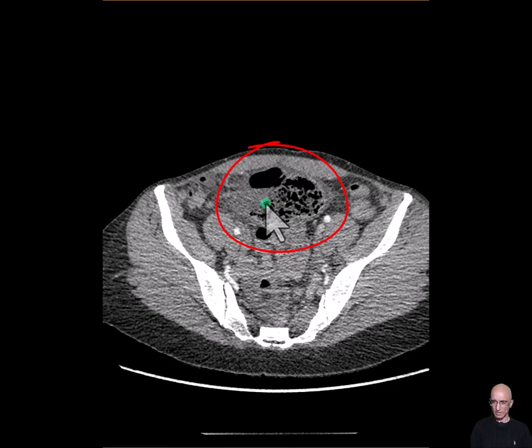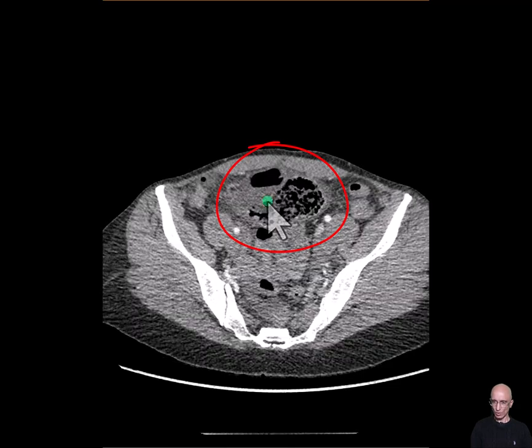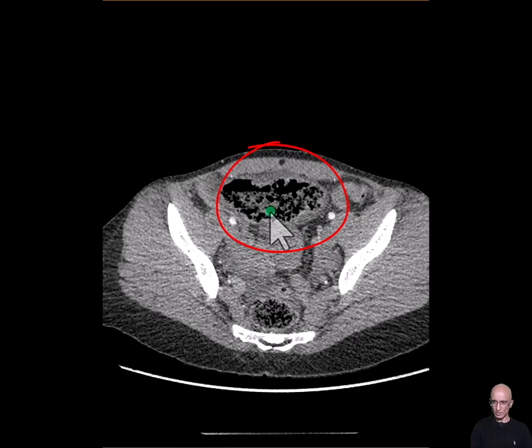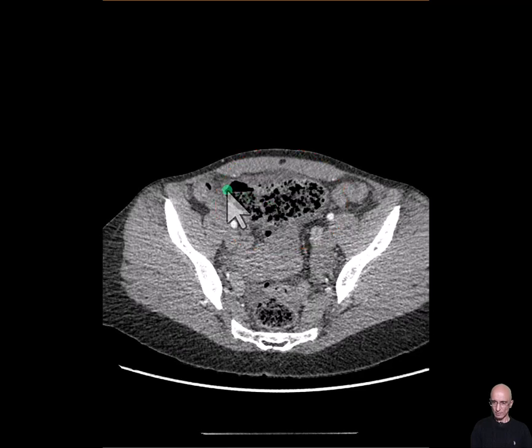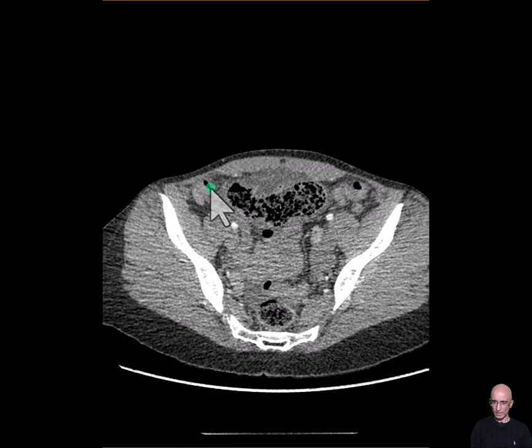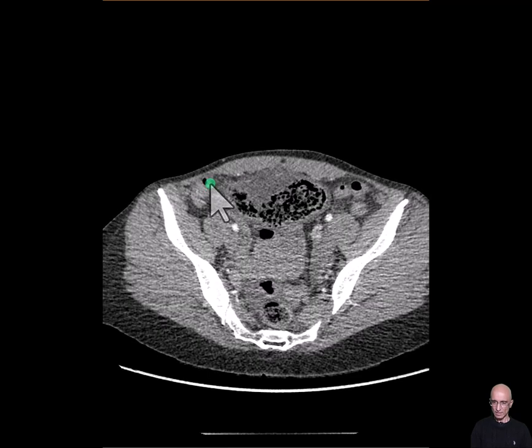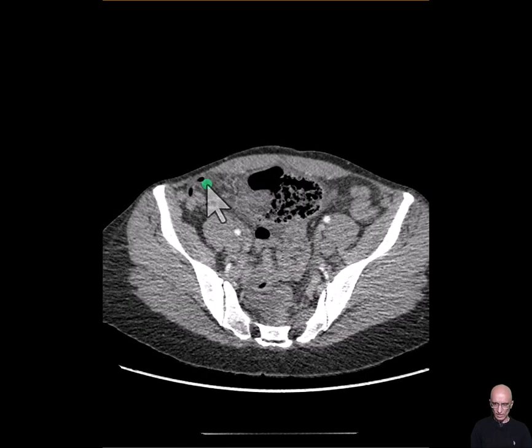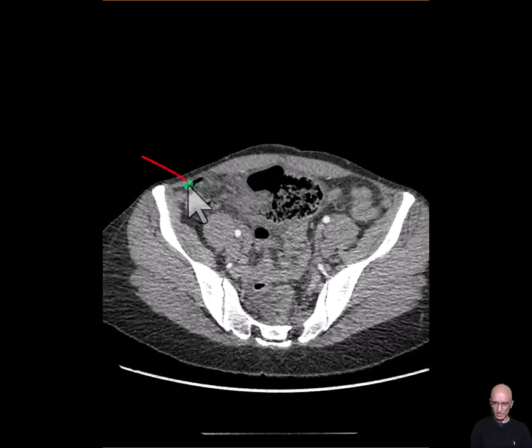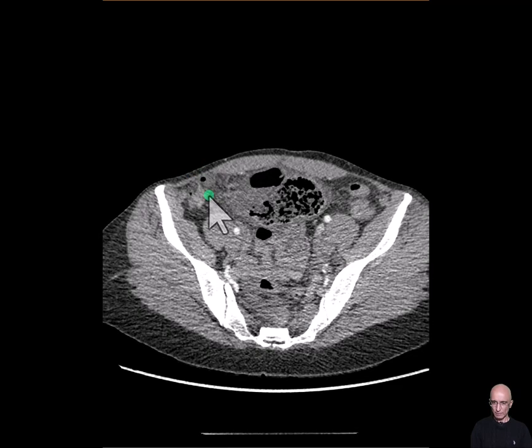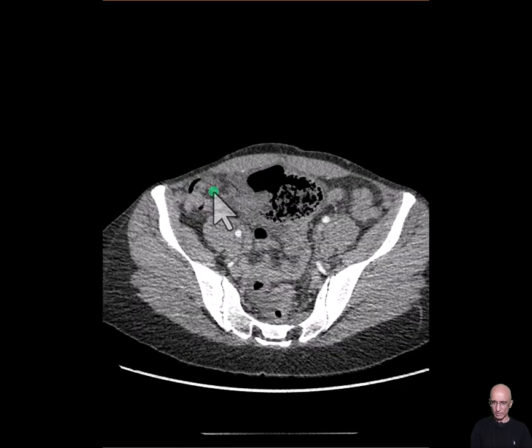The cecum is medialized with a thickened wall. As I scroll down, this is the base of the cecum, from where the appendix is seen filled with gas. It's not dilated, and there is no significant inflammatory fat stranding in the peri-appendiceal region.